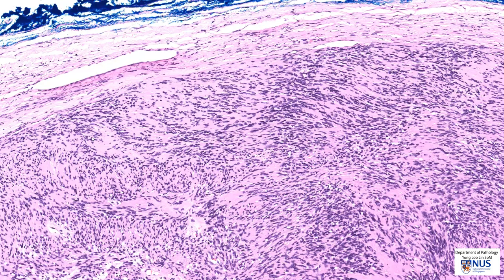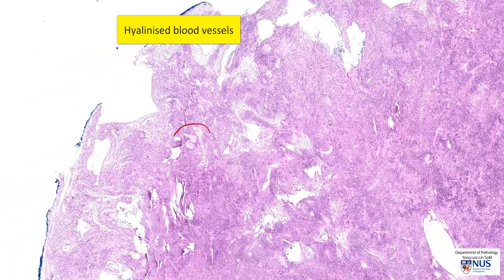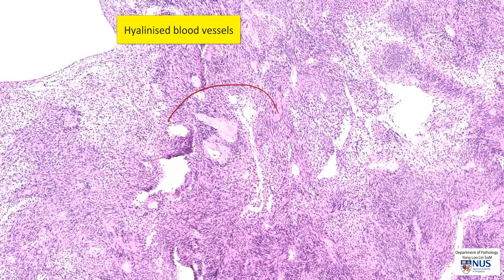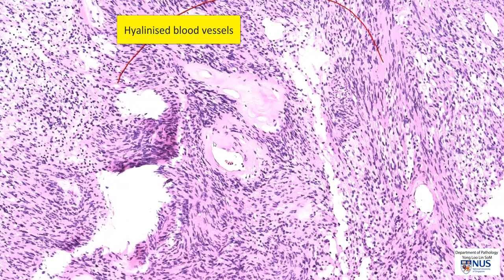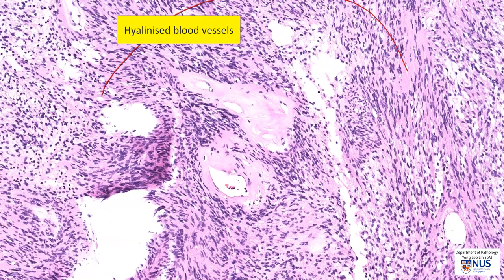We can see very beautiful nuclear palisading here. Another feature of schwannoma is the presence of hyalinized blood vessels. This means that the blood vessel walls appear to be thickened and replaced by a homogenous, glassy-looking, pale eosinophilic material. We have a blood vessel here with some red blood cells and leukocytes in the lumen, showing a hyalinized wall — thickened, glassy, pinkish appearance. And another blood vessel here with a hyalinized wall.